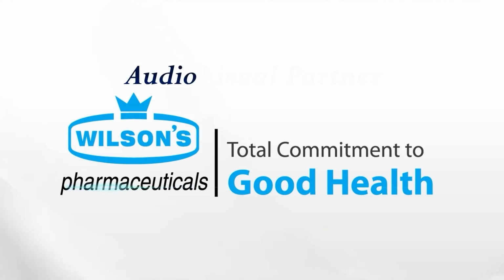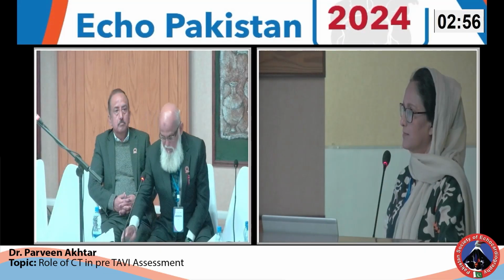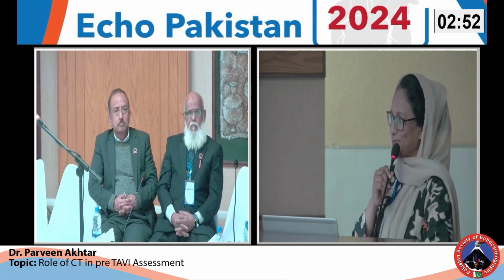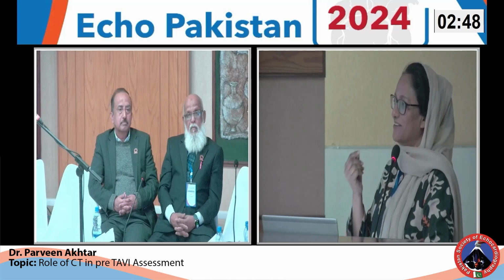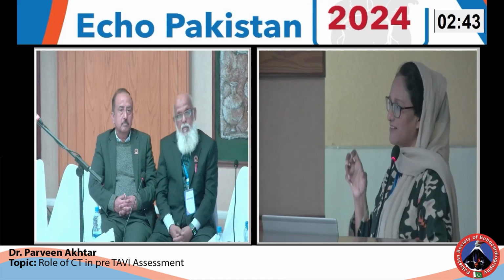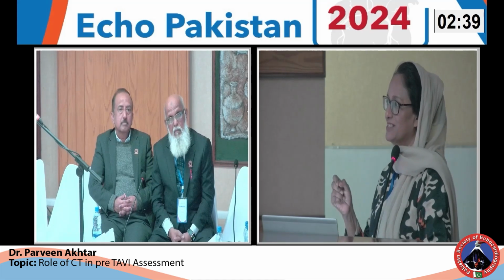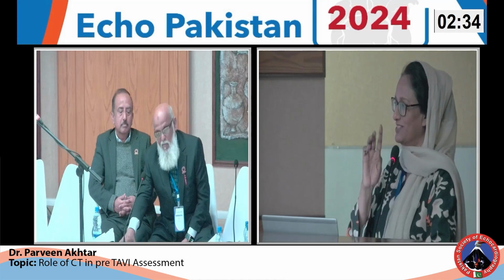Parveen, thank you very much for a good presentation. I would like to ask one question: how often are patients referred back to you after TAVI? Actually, I am not an interventionist, so the patient goes to the interventionist and then is referred to me for the echo. And if the patient has valve thickening or obstruction, then they refer to me for the CT. Otherwise, the patient doesn't follow up with me; they follow up with the interventionist.